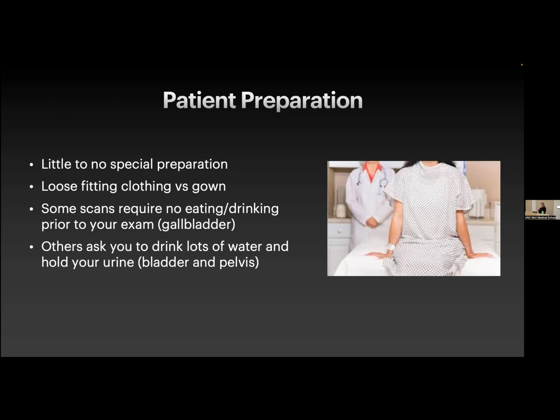So typically, that's pretty much about all the patient preparation we have. Otherwise, there's not much in terms of having to go through enemas or taking a bowel regimen or drinking something other than, or any sort of IVs. For most of these ultrasounds, this is it.